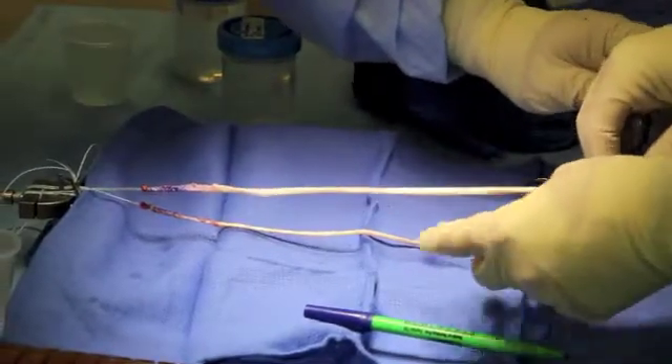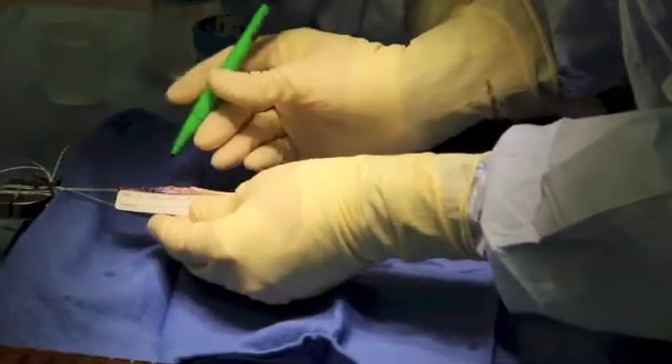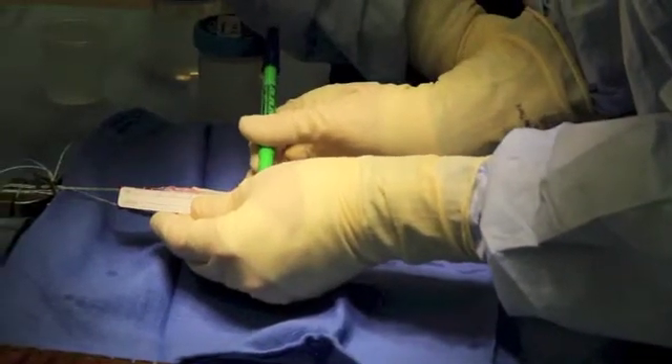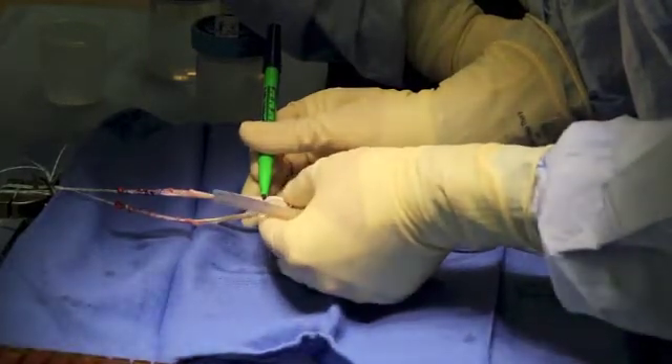First, the hamstrings are harvested via the surgeon's preferred technique. One end of each hamstring has already been whip stitched in this video, and they are secured to the graft prep board. We utilize an Arthrex No. 2 Fiber Loop Suture for this.